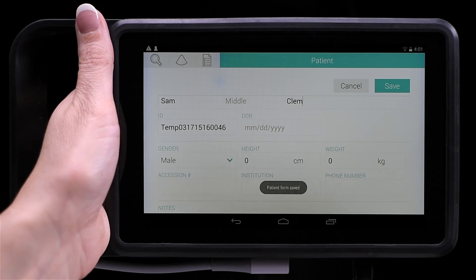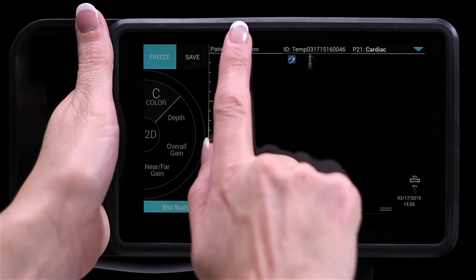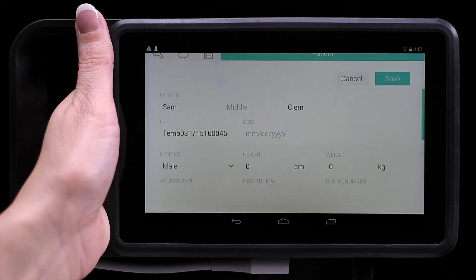And finally, you can also enter patient information after you've completed a scan, by tapping the Patient field and then tapping the Patient tab.